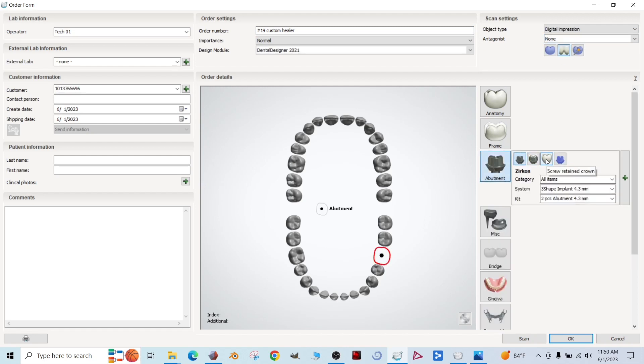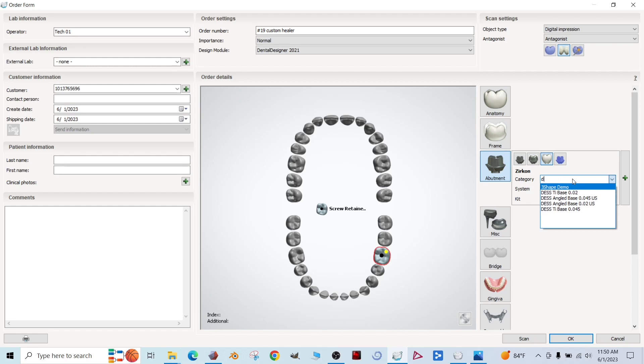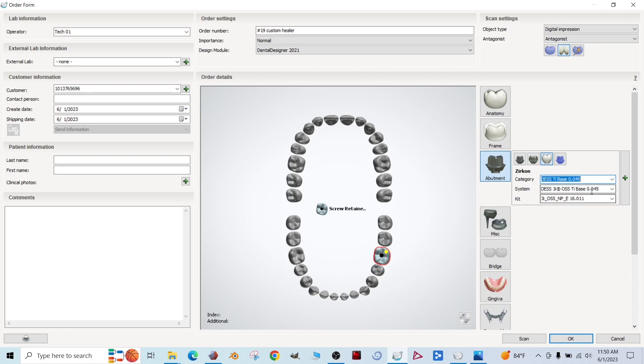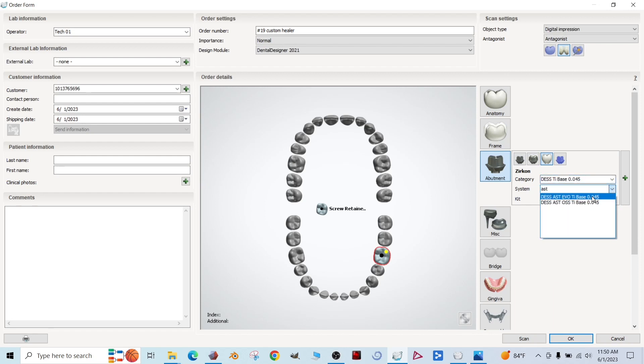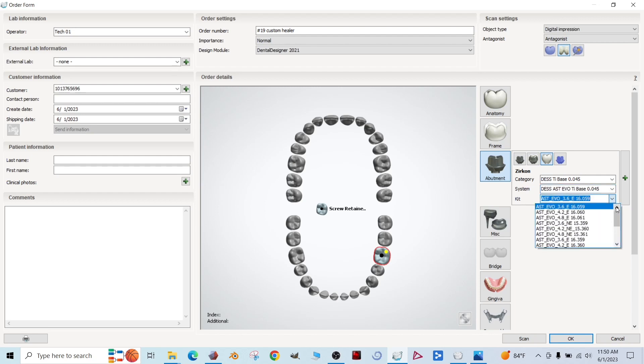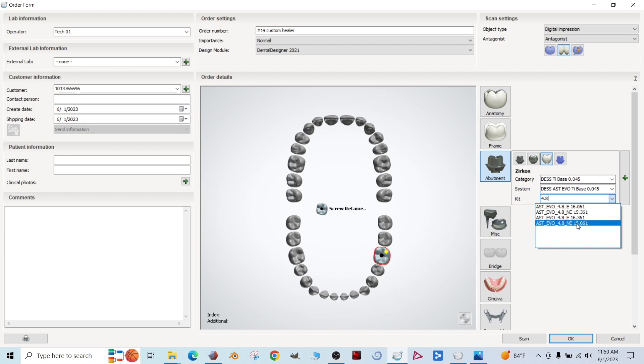We're going to do a screw retained crown. These are the DES library files here. So we're going to go ahead and use DES tie base 0.045. That's the cement gap. Let's find our Astra EV tie base. There we go.